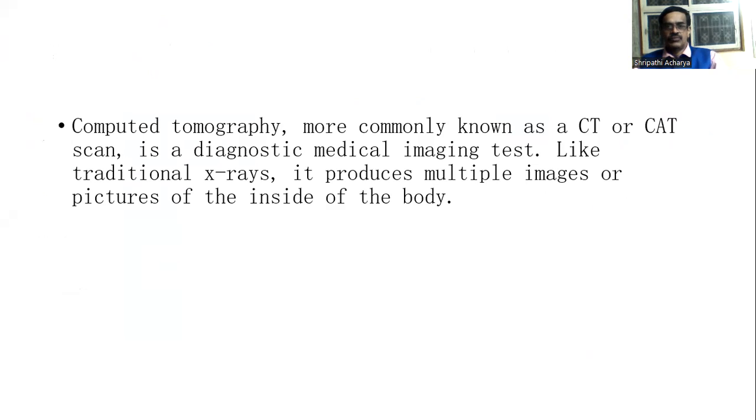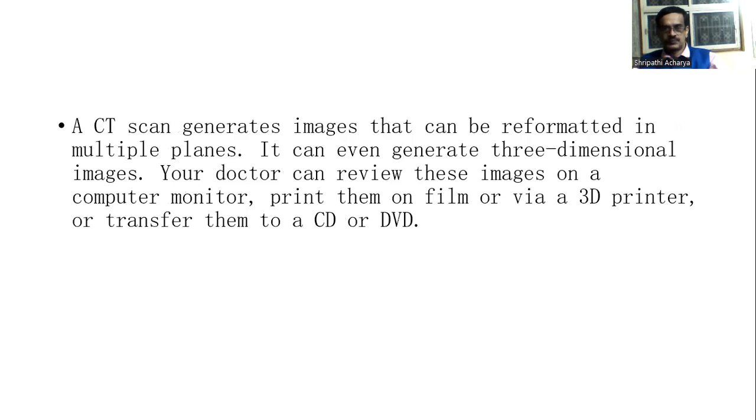Computed tomography, more commonly known as CT scan, is a diagnostic medical imaging test. Like traditional X-rays, it produces multiple images or pictures of the inside of the body. A CT scan generates images that can be reformatted to multiple planes.